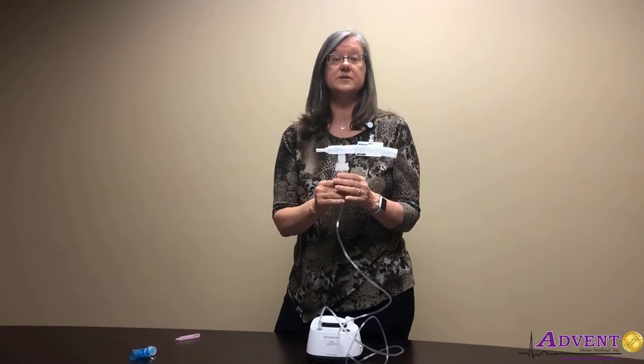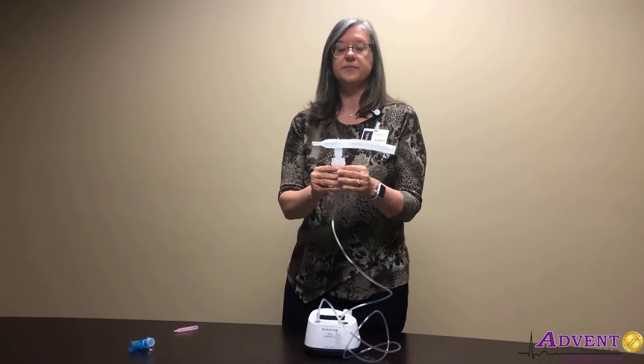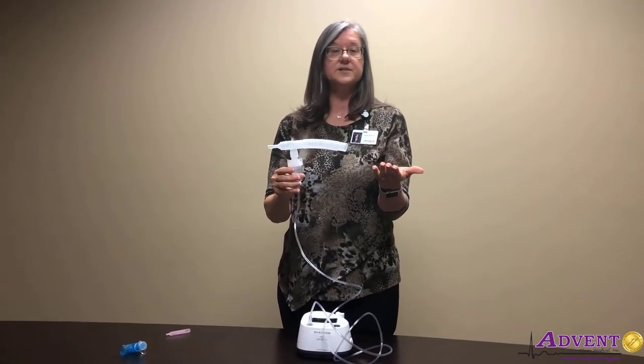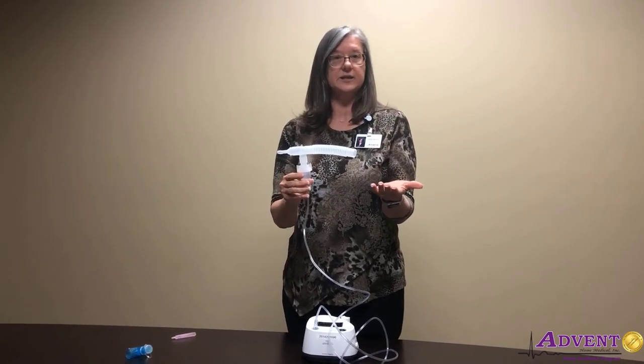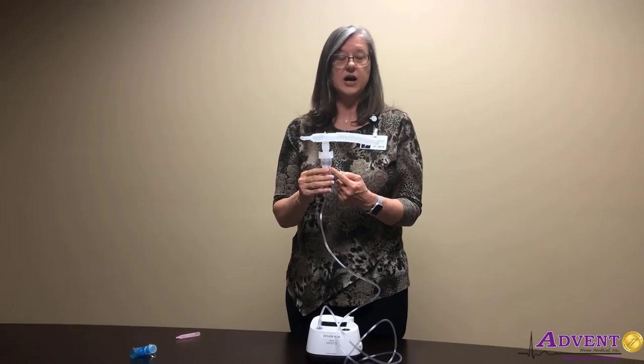You can also do this with a mask. Turn on the nebulizer and we'll see the mist from our medication — we know that it's working. Just put the mouthpiece in your mouth or mask over your face and breathe normally until the medication is gone.